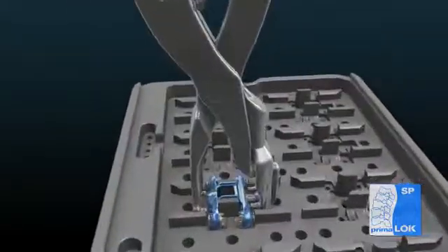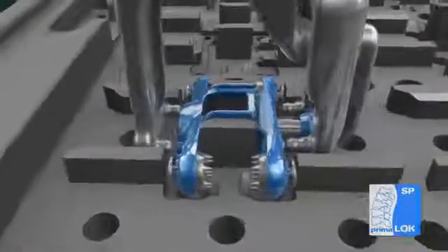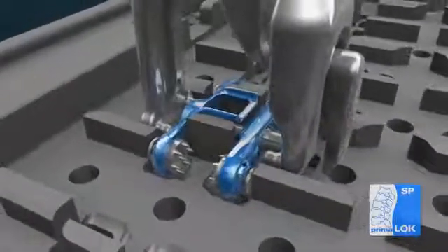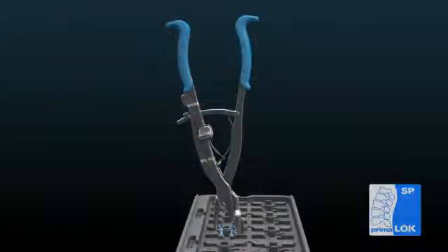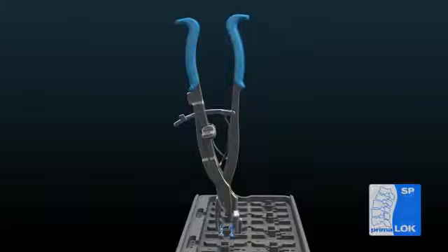Locate the corresponding implant in the implant caddy. Place the inserter over the desired implant and align the spherical tabs on the inserter with the mating holes on the implant. Gently squeeze the inserter, engaging the inserter to the implant.